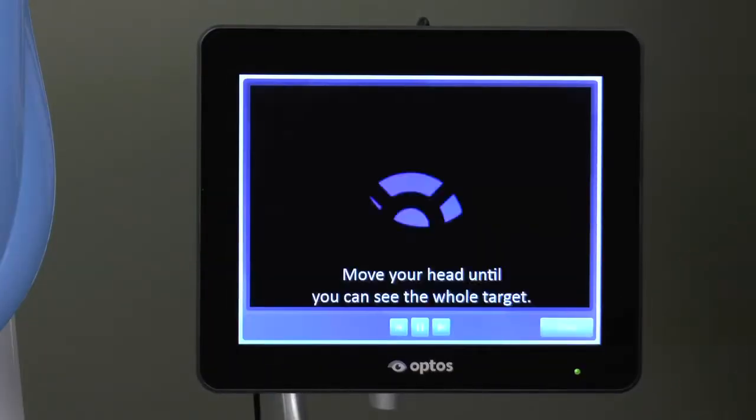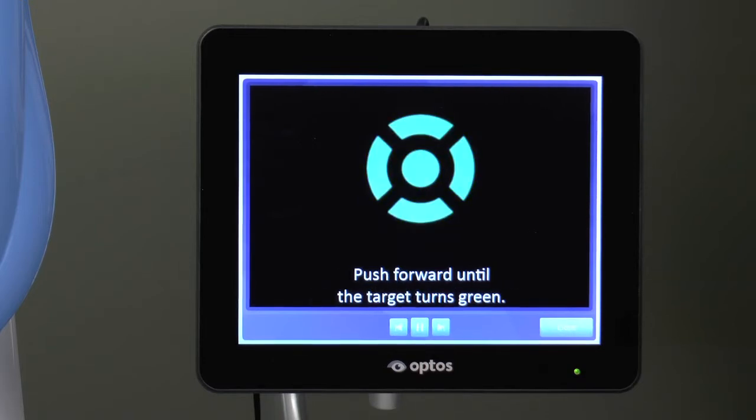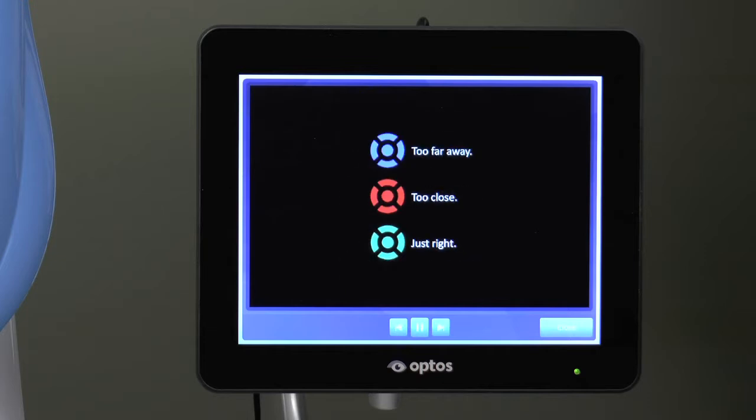Tapping on the question mark at the bottom right hand corner of the screen launches an animated video that demonstrates what the patient will see when they look into the device and how to determine when they are correctly aligned. When the video is finished, tap the close button.